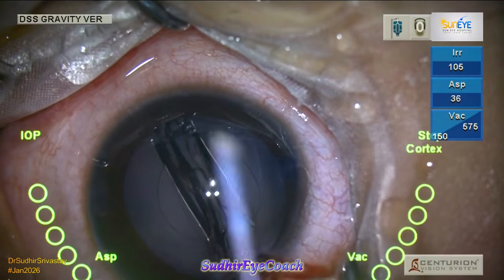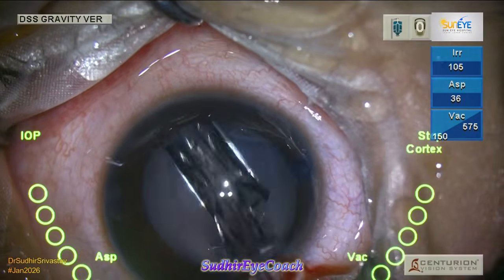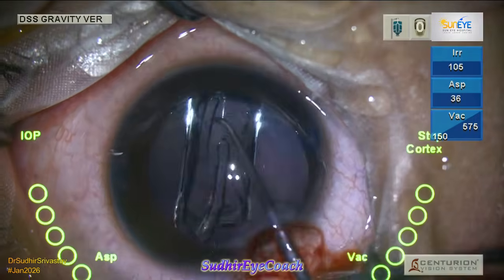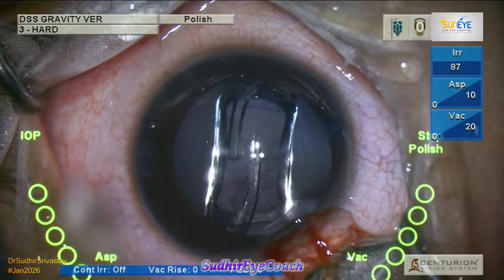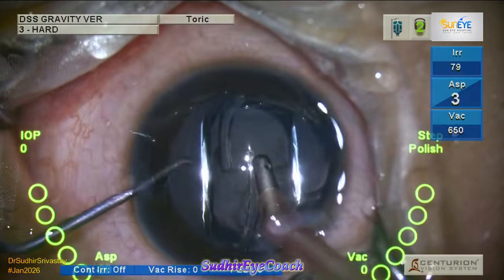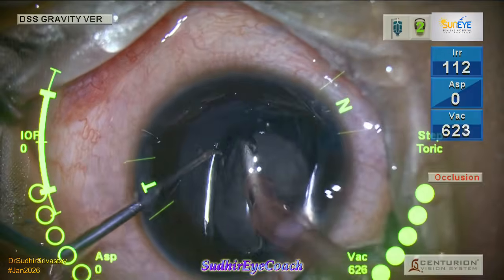In pediatric cataract surgery, the preferred choice of intraocular lens is usually a monofocal or an advanced monofocal lens with or without toric correction. In this case, I implanted a hydrophobic single piece toric intraocular lens and aligned it precisely as per the planned axis.